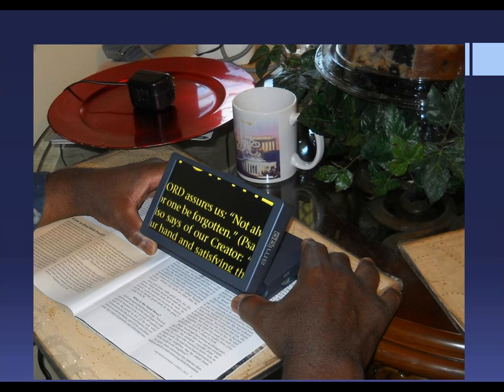This gentleman is a minister, and his goals were to be able to read scripture from the pulpit and to read at home for pleasure. The Amigo enables him to do both. Notice how the screen tilts for comfort and glare control. It's very lightweight, portable, and is battery-operated.